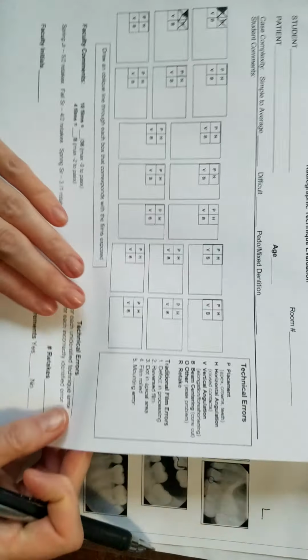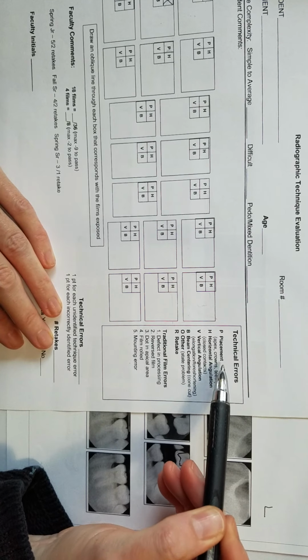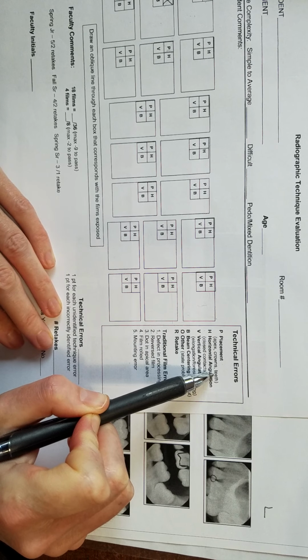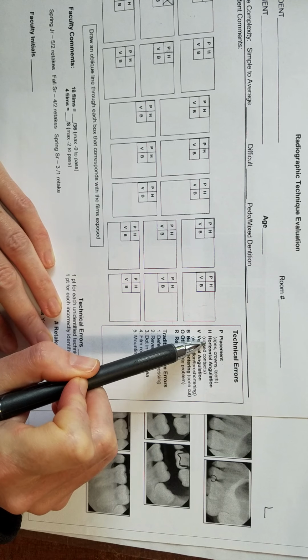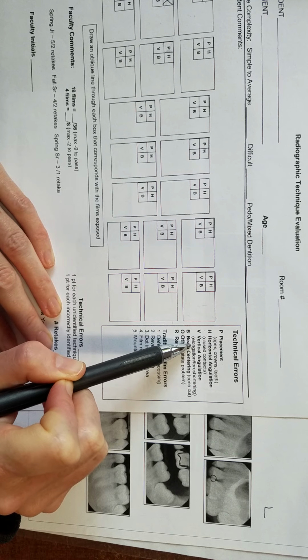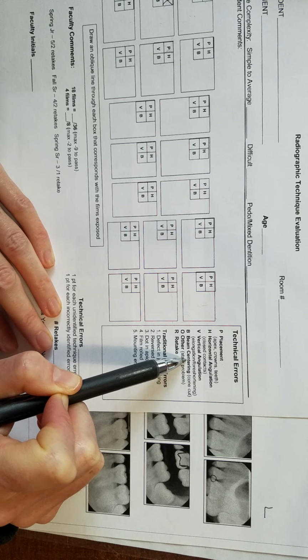So if you look over here at the technical errors, you have placement. That's if you can't see the apex, you can't see the crown, you can't see the teeth that are supposed to be in the image. You have horizontal angulation, that's closed contacts. Vertical angulation is elongation or foreshortening. Beam centering is if there's a cone cut.